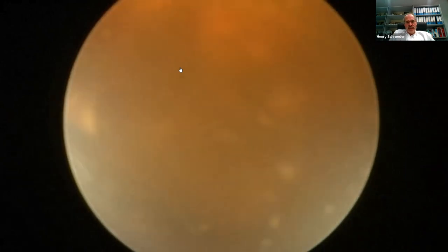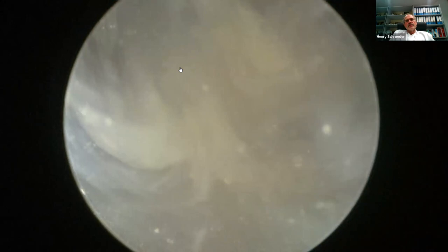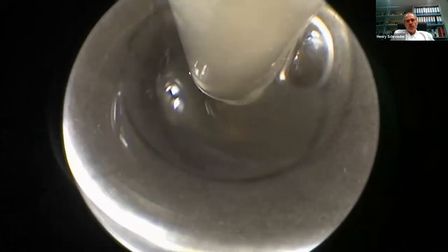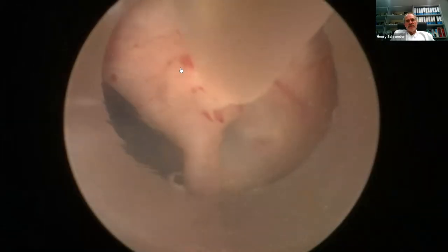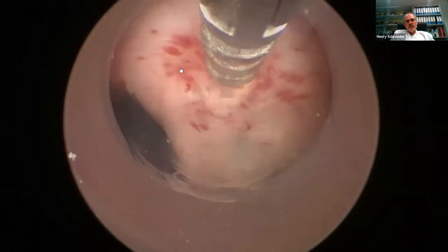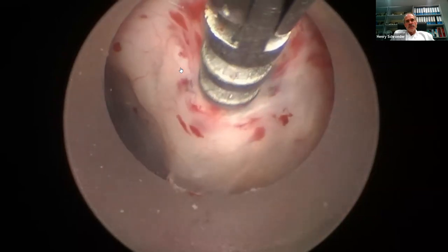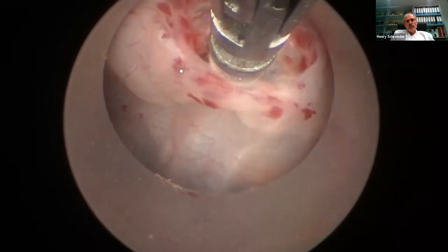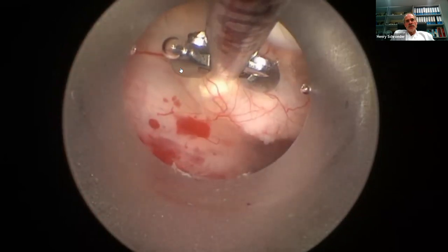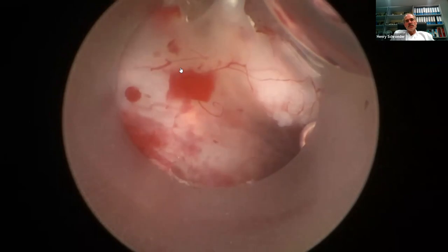So we take an aspiration tube, aspirate most of it. Typical small crystals here. So we evacuate the cyst. Open it, and then we evacuate it with a suction tube, and then we make a resection. But of course, we make not a gross total resection, because in these cases, if you take all the tumor out, you will destroy the stalk.